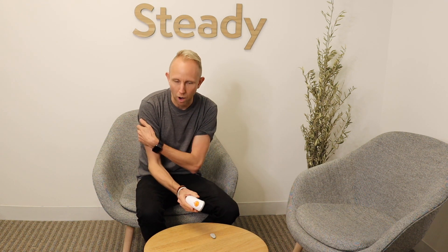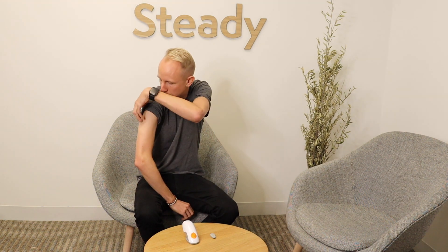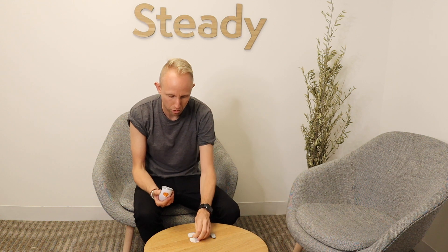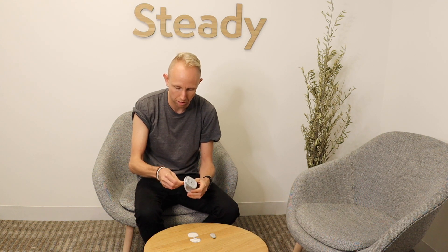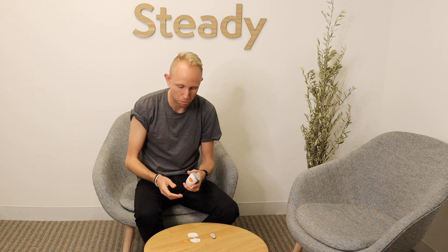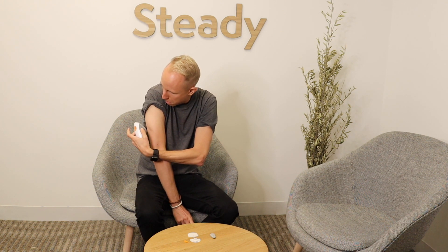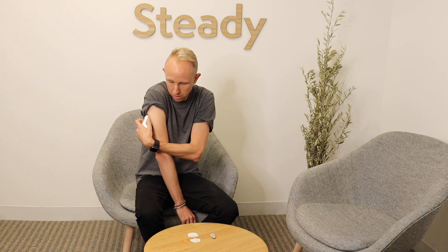I'm going to insert the sensor on my right arm today, but you can also place it on your abdomen or on your back — it's a little up to your personal preference. I'm going to roll up my right sleeve and take off the protective plastic on the front. Make sure to keep the little sticker with the code that you'll use in the phone app later. Then wiggle off the protective plastic above the insertion button. The trick is to find a spot on the back of your arm that is out of the way but also avoids any piece of muscle. Stick it on, press it up against your arm, and then press the orange button.